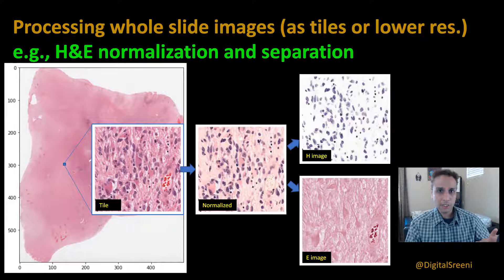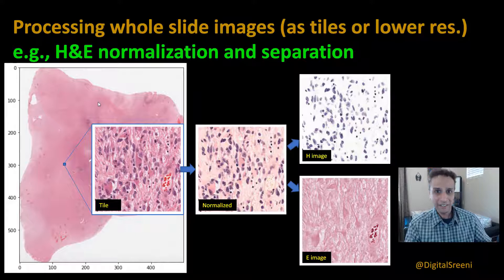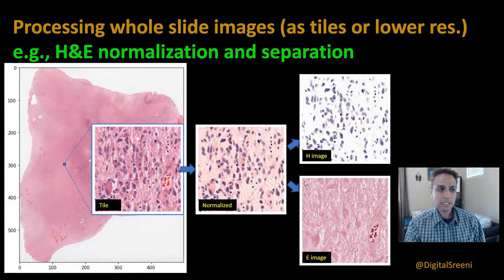Normalization always helps for any downstream processing, so that's why I chose this application. I covered this specific topic a long time ago, so I'm not going to talk too much about the actual approach of how we are normalizing these images, although I'll refer you to a useful paper that my code is based on. The point here is we are extracting every tile from this large image, and while saving it locally we are going to process it by normalizing and separating the H and the Eosin components digitally, saving these as separate entities.